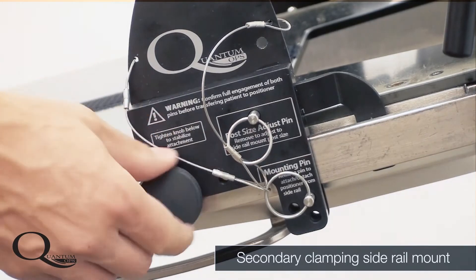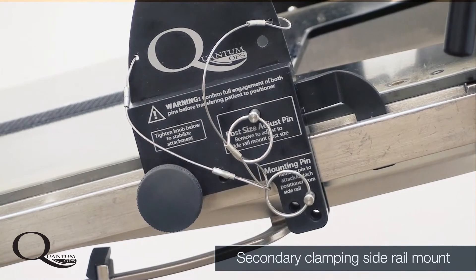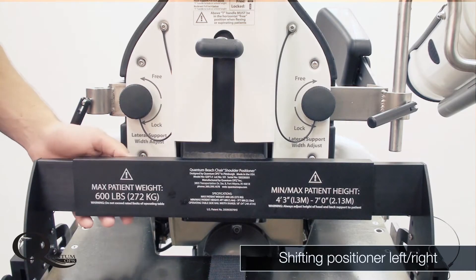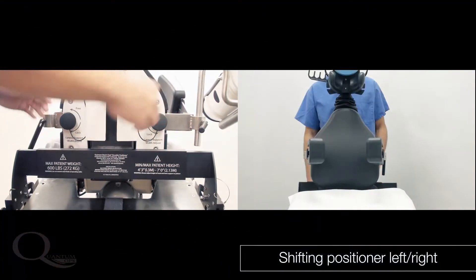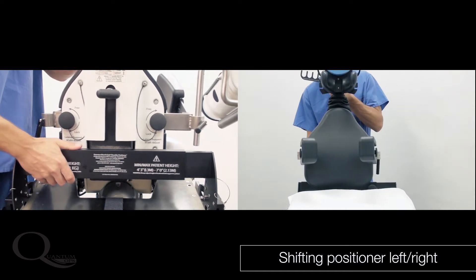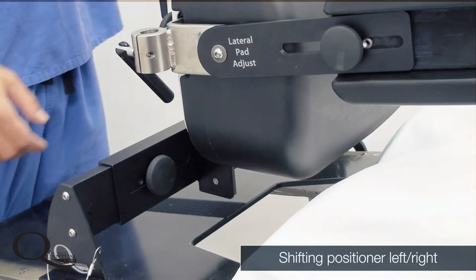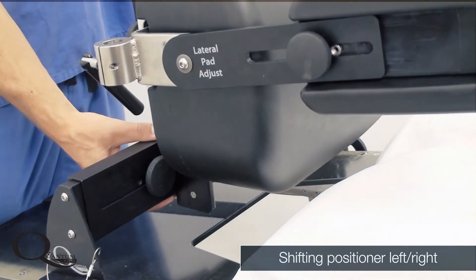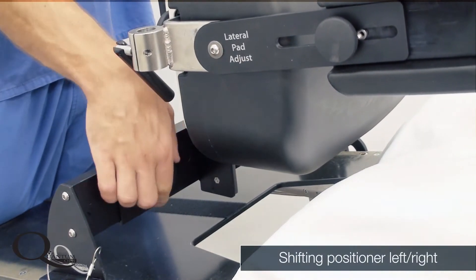If desired, the secondary clamping side rail knob can be tightened onto the side rail to provide additional stability. The Quantum positioner can be shifted left or right based on surgeon preference and patient size by simply loosening the two knobs on the front of the base tube. This is best done prior to the arrival of the patient, as it is much easier to shift the positioner before the patient is on the bed.